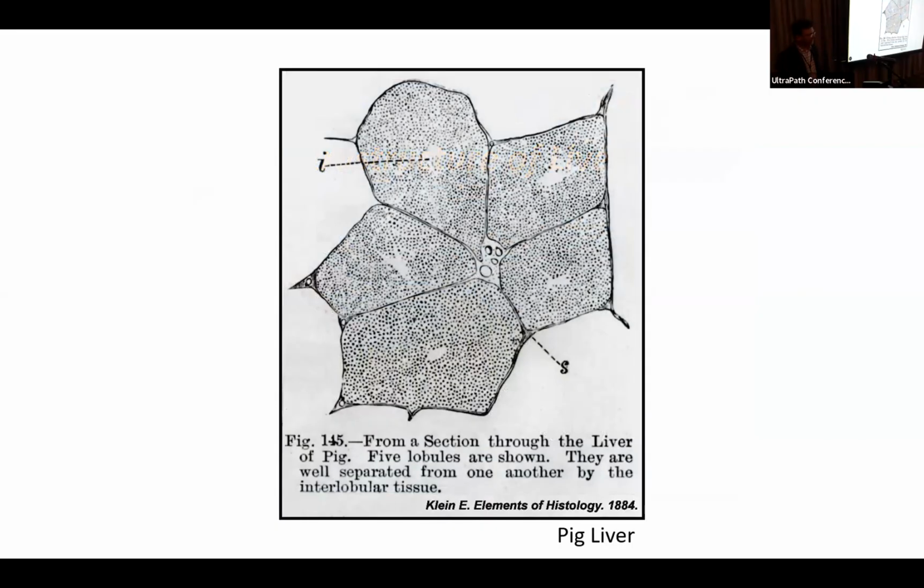I think perhaps more than any other tissue, the ability to visualize the liver's 3D structure really enhances our ability to understand what we're looking at when we're looking at electron micrographs. I believe that liver is probably one of the more underutilized tissue types for electron microscopy.